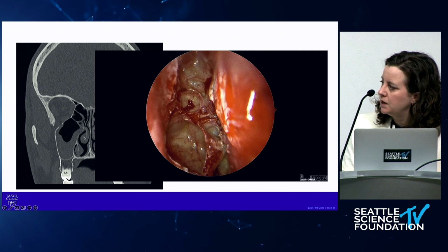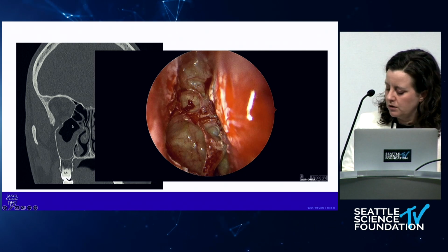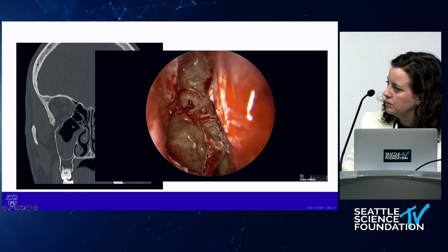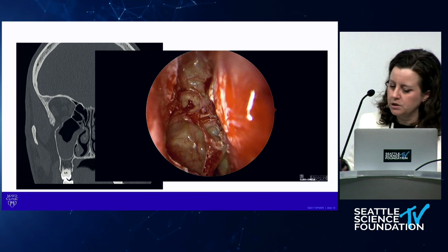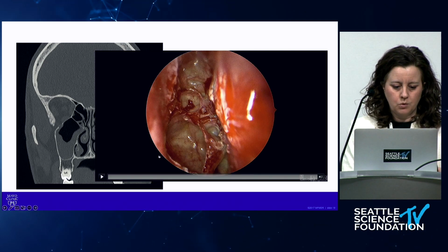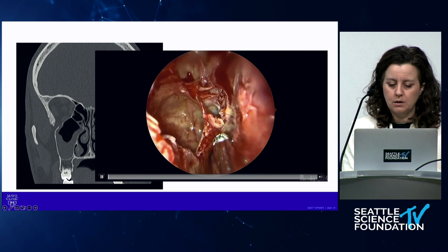So this patient, and we were looking at his anterior ethmoids before. We did his maxillary, opened up his anterior ethmoids. His configuration is a little bit different. He doesn't have a very broad attachment of the basal lamella, at least for that horizontal portion. But we're going to come through.